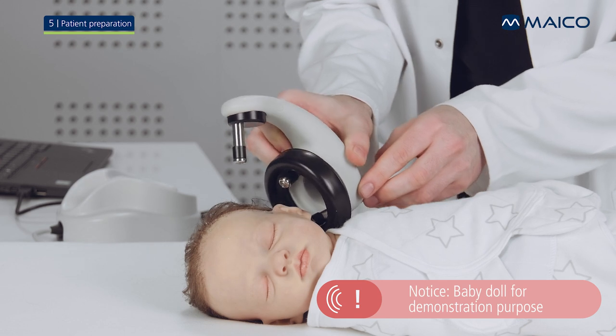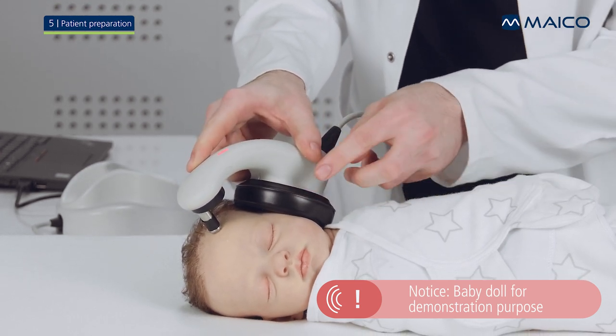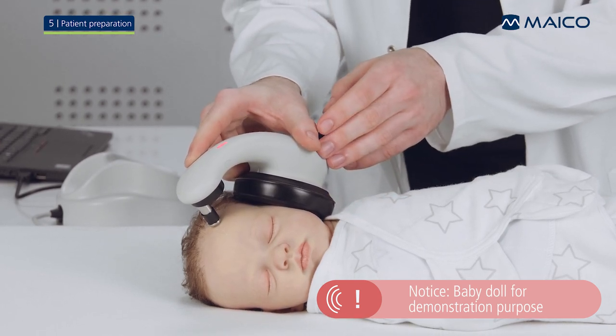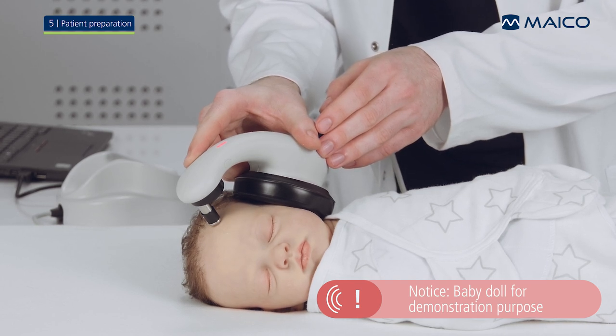Place the Barafone on the baby's head making contact with the prepared spots. Check that the ear cushion contacts the skin all around the ear with no gaps. Support the Barafone in place during the test but do not apply pressure.